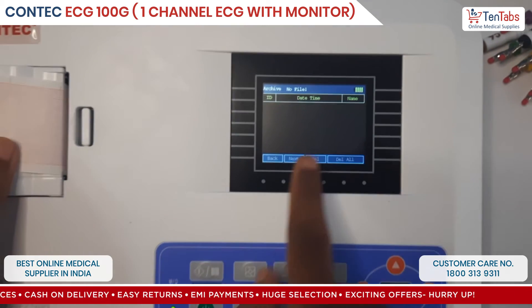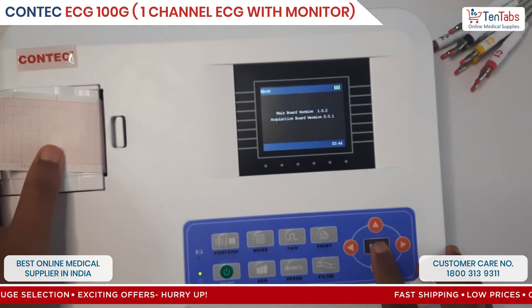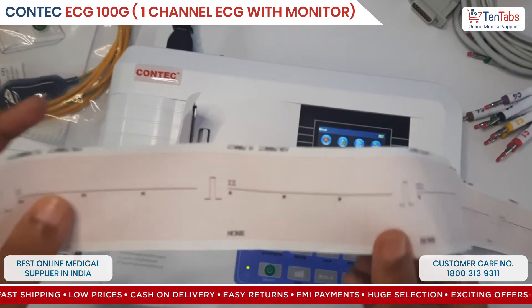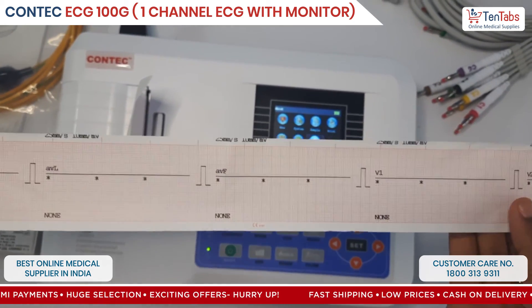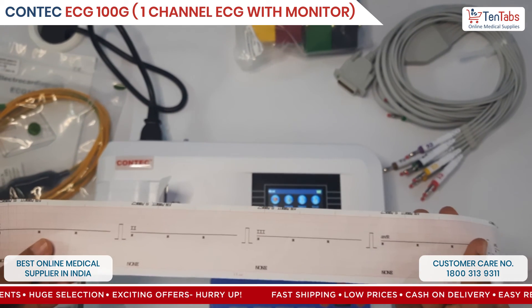Old patient details and some basic information about the device are available here. This is just a sample report showing how a single channel print has been taken — just for reference. This is the print format.